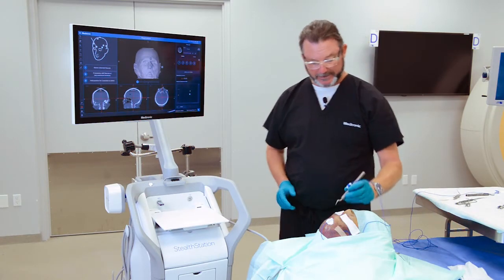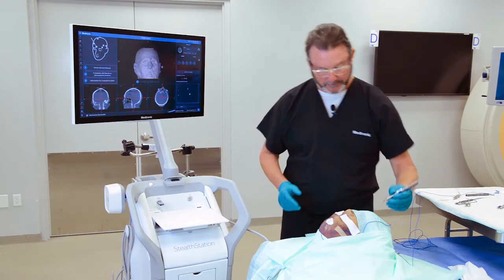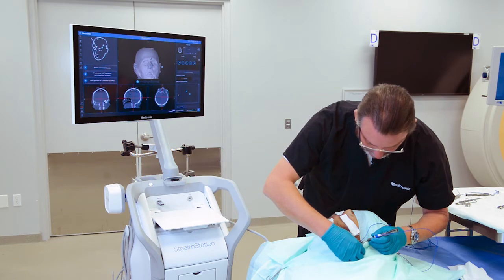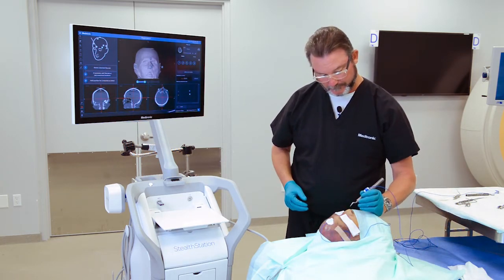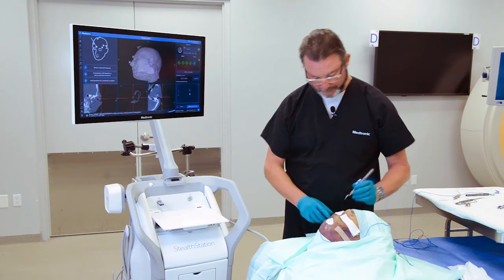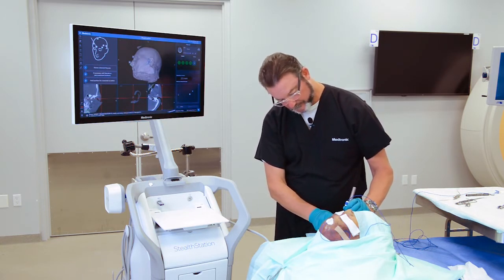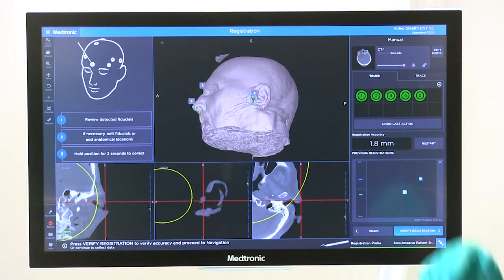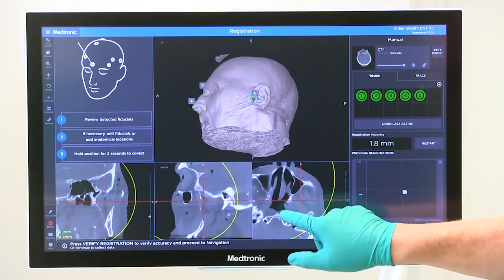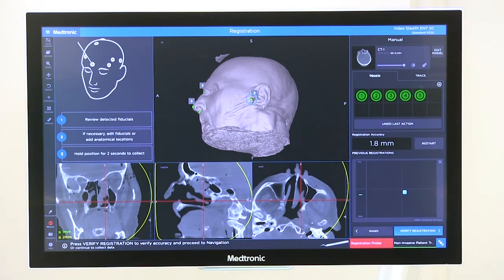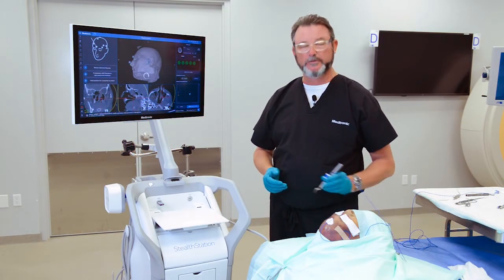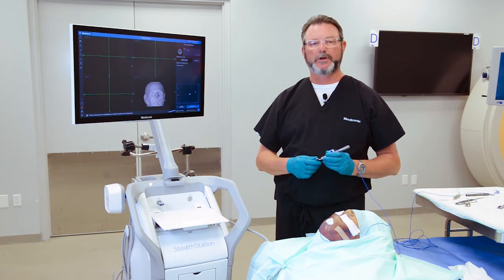Then you'll take your registration probe and touch those same five points. You'll receive the same sort of accuracy information, or predicted accuracy information, that you receive with the other methods. Here you can see we have a nice large two millimeter zone. Again, we recommend that you check anatomic landmarks to make sure you agree with the registration.